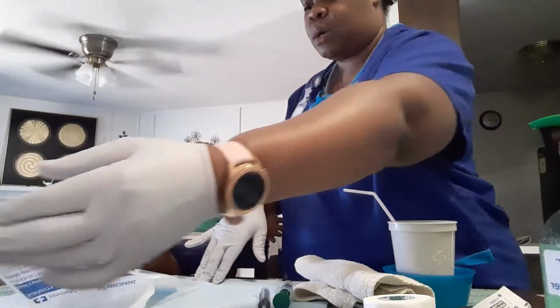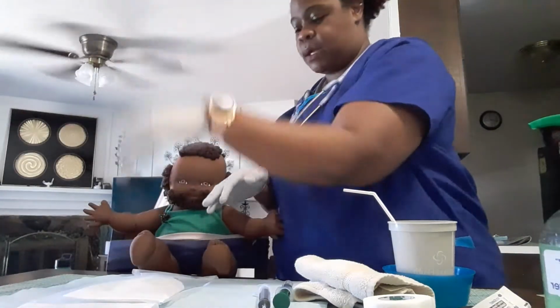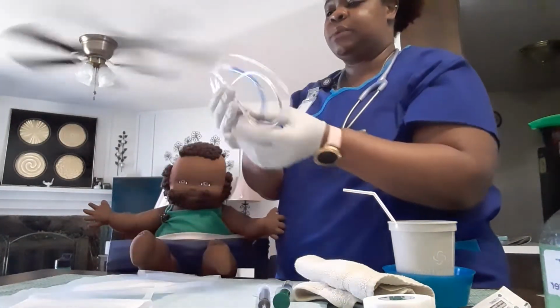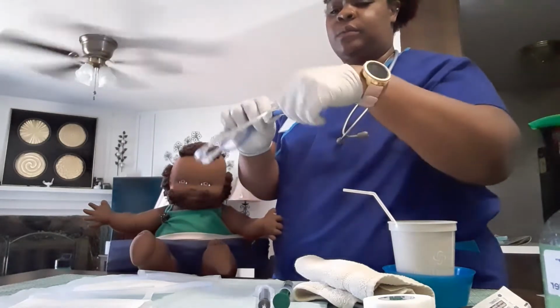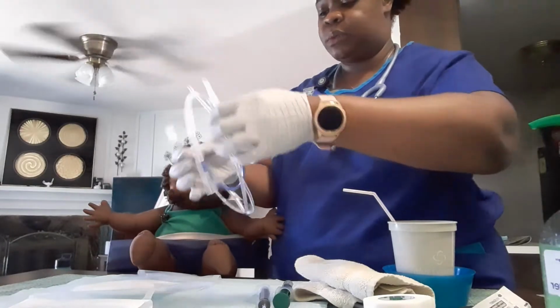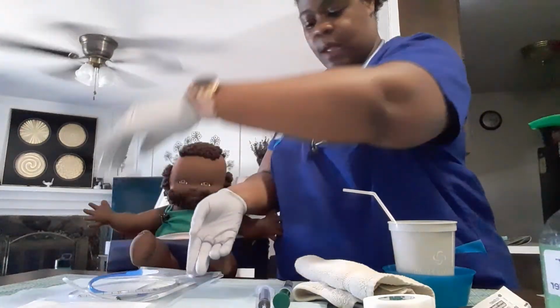I am going to open up my NG tube packaging. Check my tubing. It's in place. I have this piece put into place. I'm going to set that there.